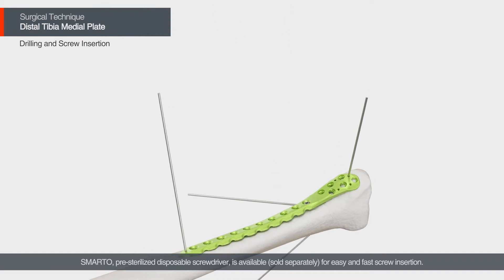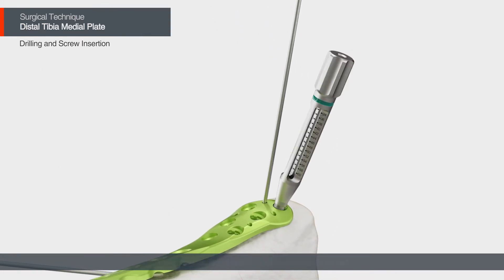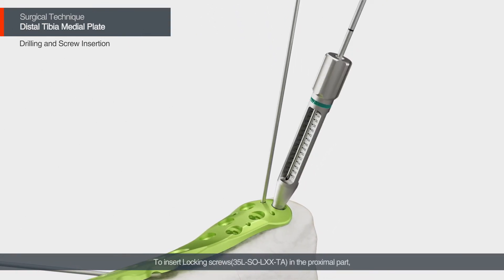To insert locking screws in the proximal part, the use of a drill sleeve is recommended for drilling in the pre-defined screw angle.